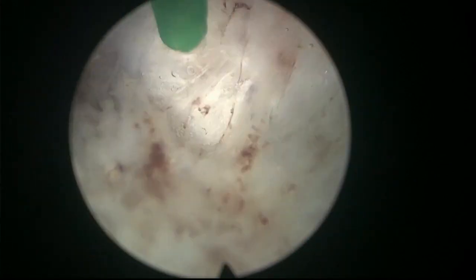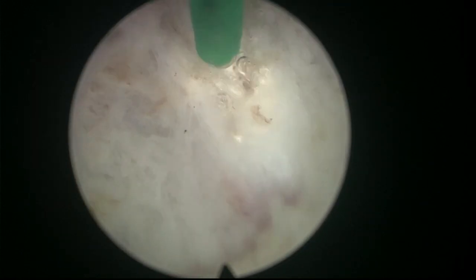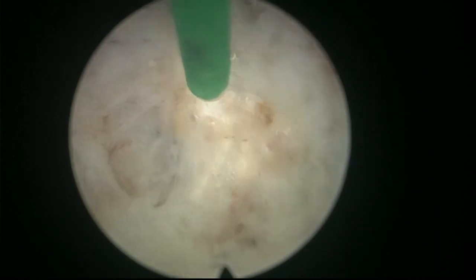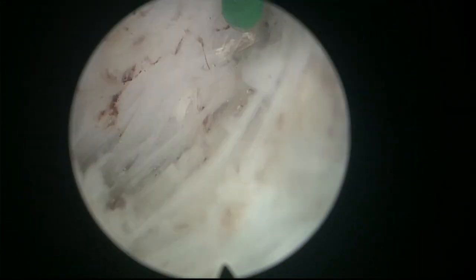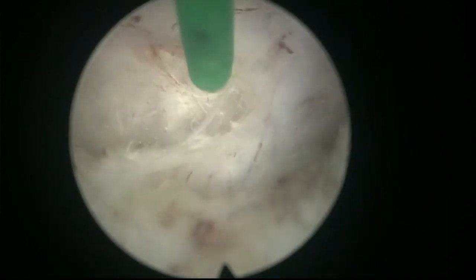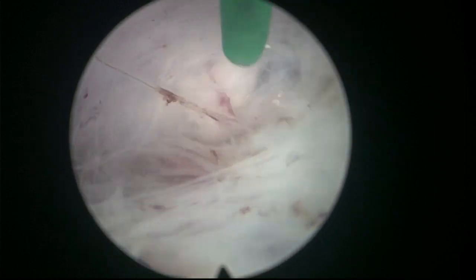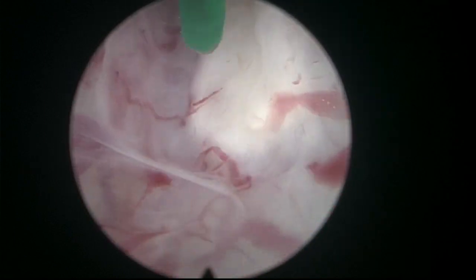Here we are. Again, follow the curve of the prostate. You have to get close to the prostate so you don't get into the prostatic capsule. Right here, sometimes the plane is not completely clear, but we will follow the shape of the prostate. It's a big gland, yeah? But we are enjoying the excellent quality of hemostasis provided by MoLEP. So it gives us a lot of confidence to progress and not worry so much about hemostasis, as the quality of hemostasis as we go is excellent.